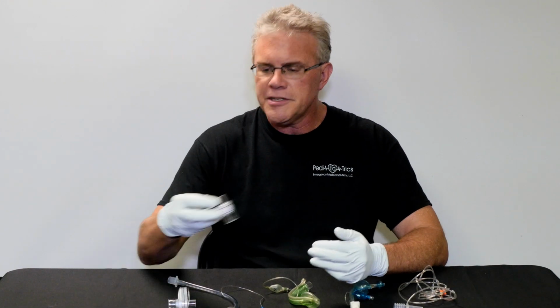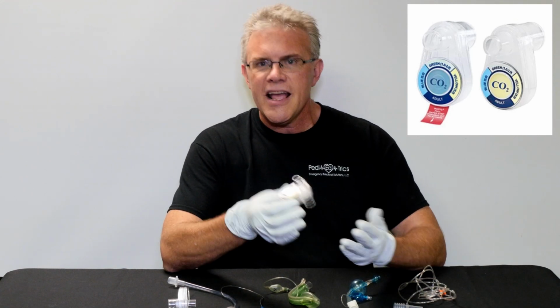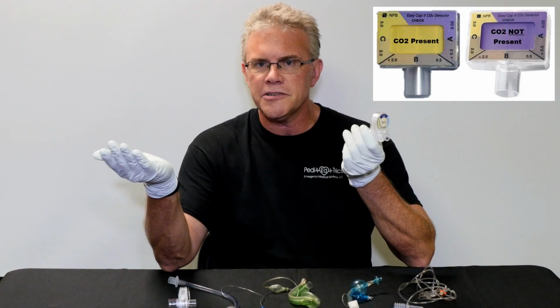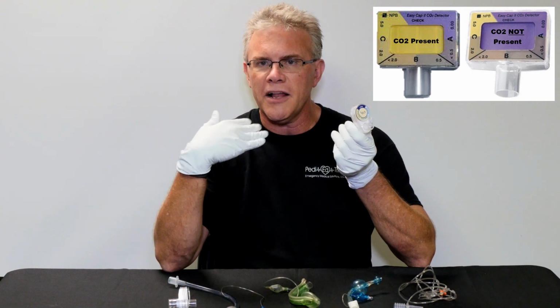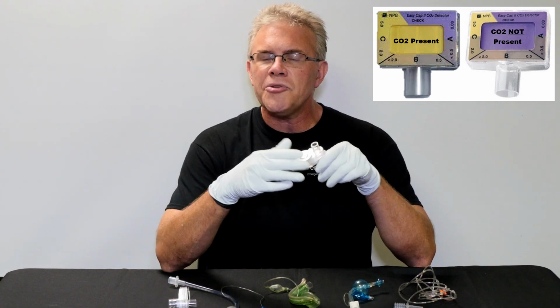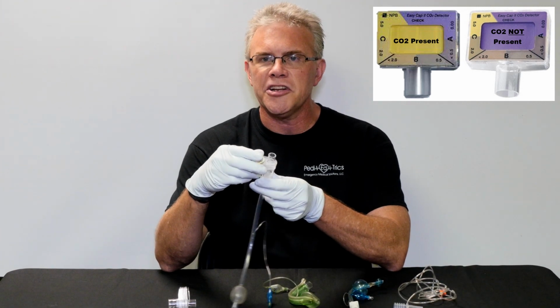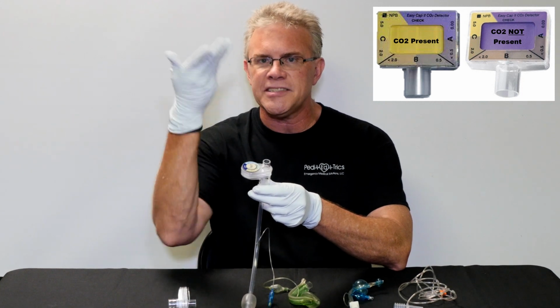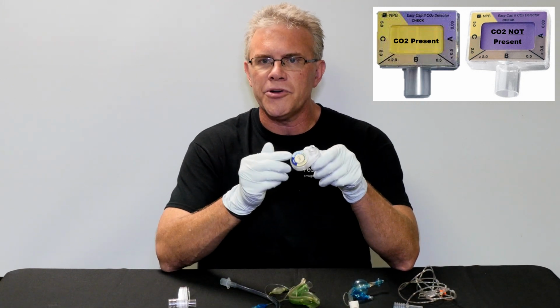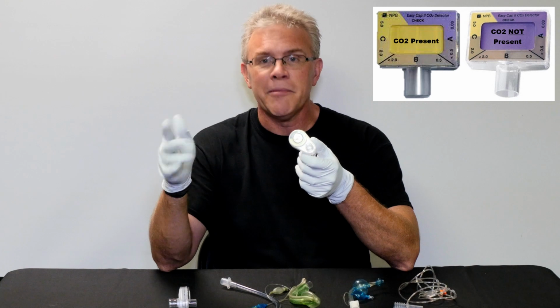The first of which involves these things. Remember that these are your colorimetric devices, otherwise known as they change colors. Essentially, they're just a piece of litmus paper, meaning that in the presence of acid, they change colors. Remember that when you inhale oxygen, you exhale CO2, and CO2, you remember, is an acid. So the idea being that when you hook this thing on the end of the tube, as long as your patient's alive, meaning they're actually producing and exhaling CO2, it's going to change colors. And if it turns gold, gold is good, your tube's in the right spot. And if it turns purple, and your patient turns purple, it's in the bad spot.